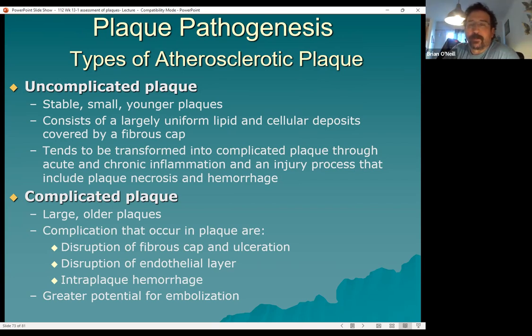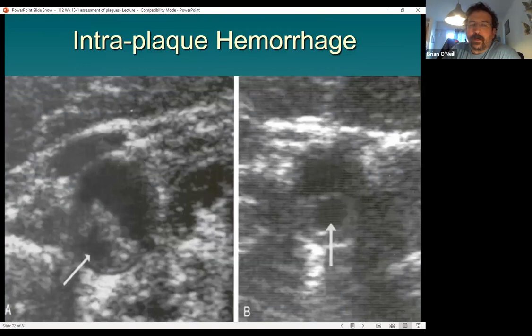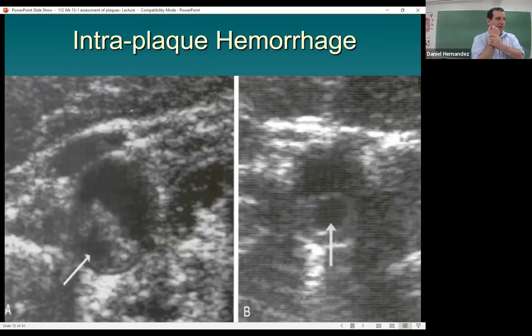How often do you see this type of thing in a patient? Like outpatient, are you going to see this more after they've already had an incident, or if they're displaying no symptoms in the ER? You definitely would see it outpatient.